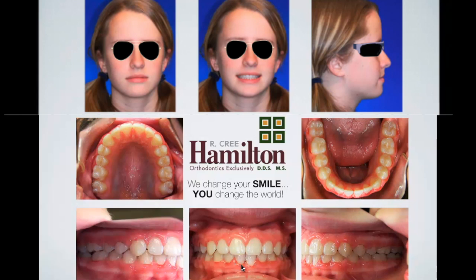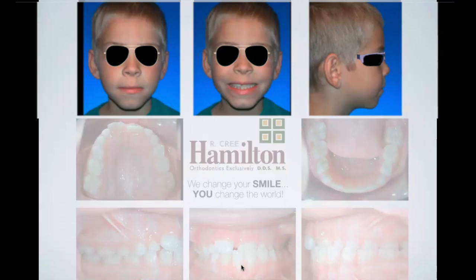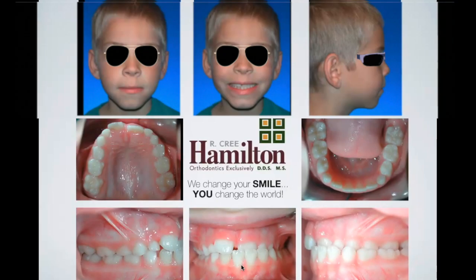We also have a standard prescription. So in a case like this, where you know there's going to be a higher likelihood, something you see on the x-ray, the root's already forward, you could actually program in more lingual root torque on that tooth or all of the anterior teeth in order to get the roots back into the bone where you want them. So that's something that I think you're going to see more and more of, the more customization that we're able to do. All right, next case here.